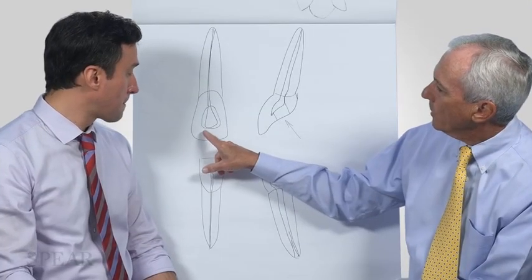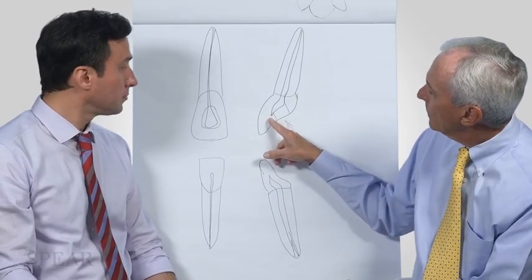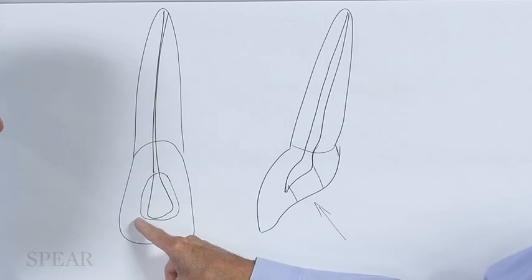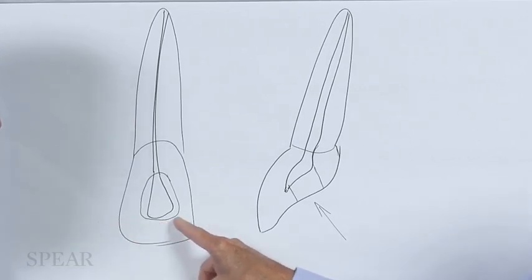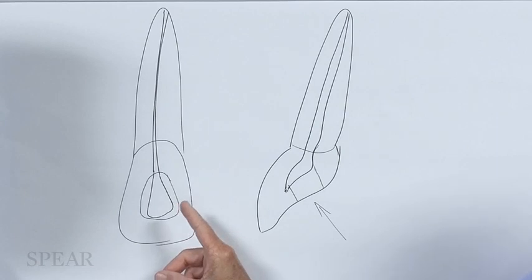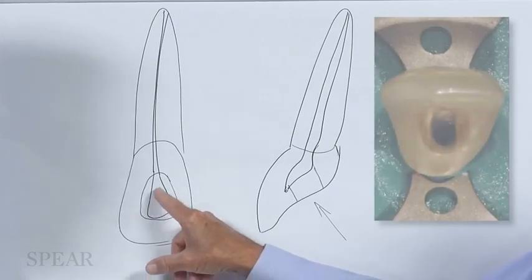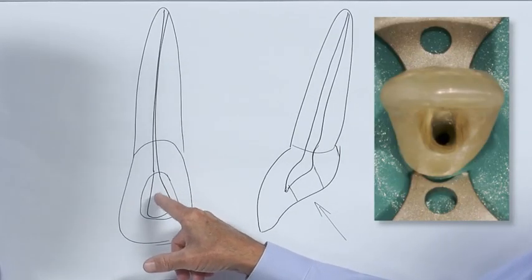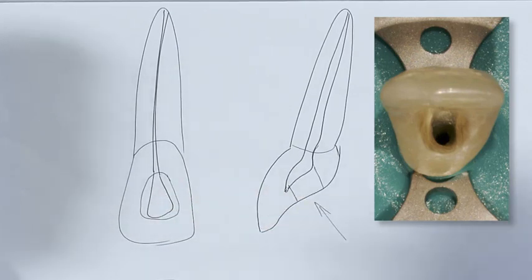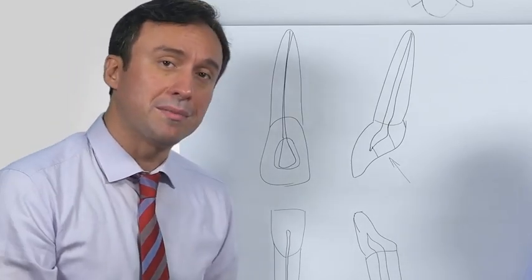Two things that I think are really important: Ali, you kind of mentioned it and showed it right here, this overhang has to be cleared along the entire mesial to distal breadth of your preparation, not just a pinpoint place. Yes. The other is that the most common error I see for a novice working with an anterior tooth is putting a round hole into this tooth and working from a round hole. A round hole is not an access preparation. Absolutely right, a round hole would be a mistake.